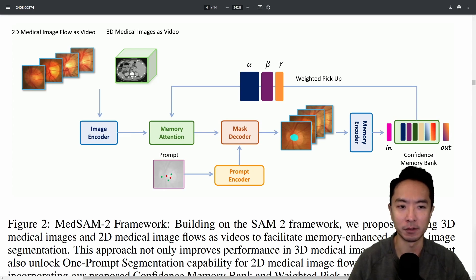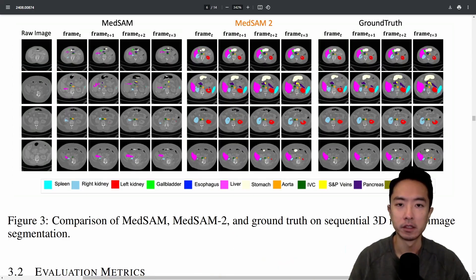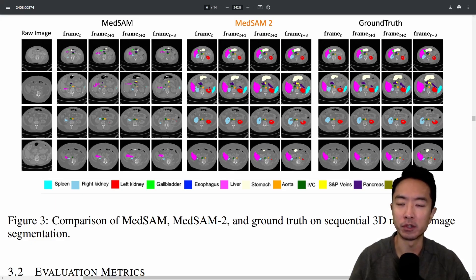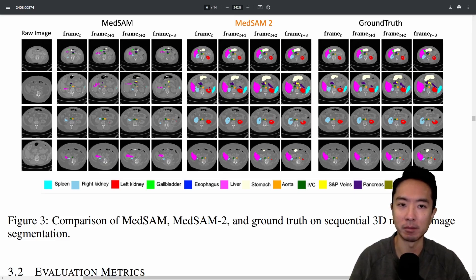There's a feedback loop with some weights, and then finally you get an output. You can see here the comparison between the older version, MedSAM, and the current one, MedSAM 2, as well as the ground truth. MedSAM 2 is performing much closer to the ground truth.